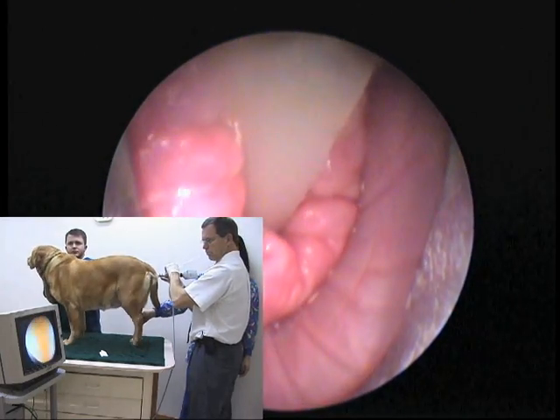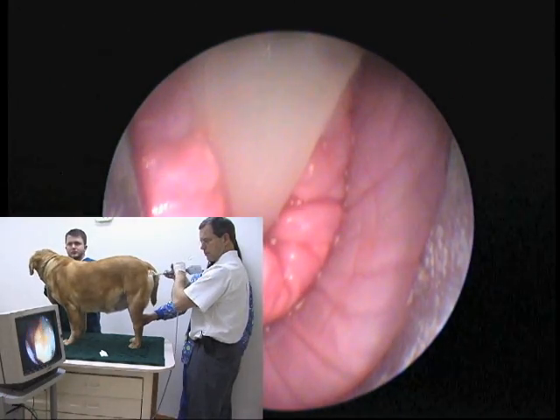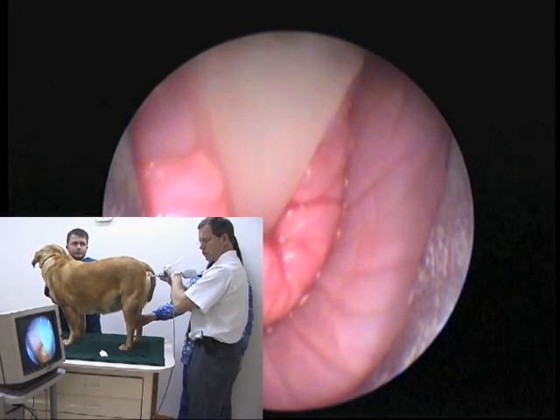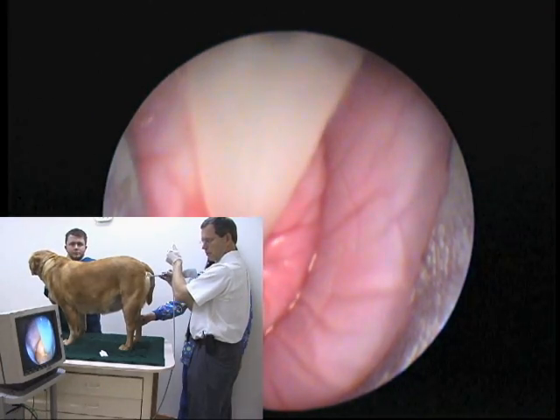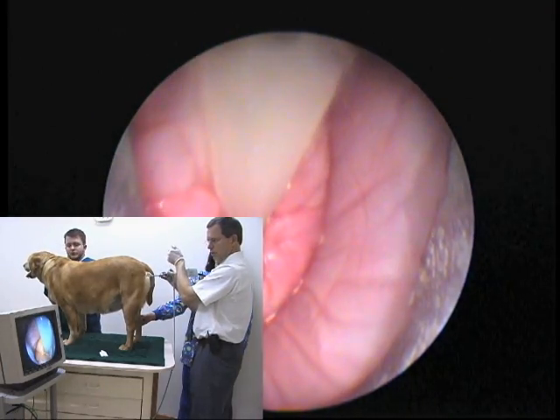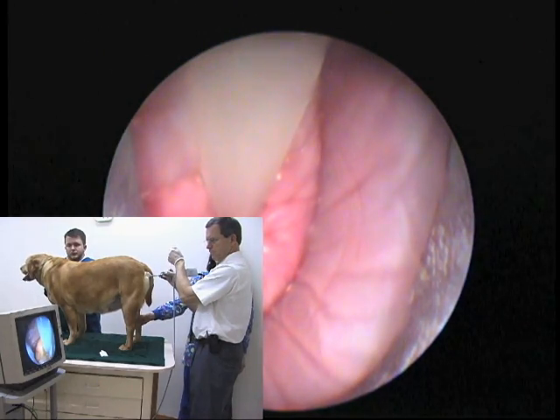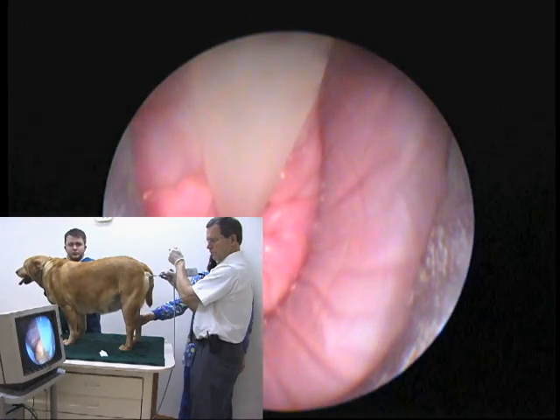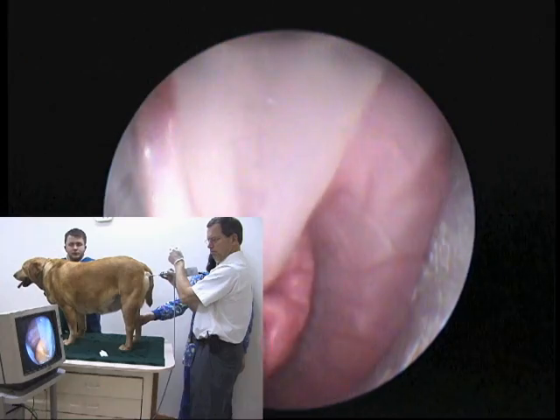For large dogs we have 2 ml of semen; for small dogs we do about 1 to 1.5 ml. We do a very gradual entry into the uterus with the catheter, and we also put the semen in fairly slowly so we don't suddenly dilate the uterus and have it constrict and eject all the semen. Once we finish the breeding, we remove the catheter, remove the scope, and we do not have to hold the bitch up at all after the breeding.